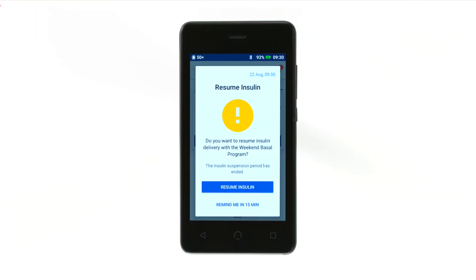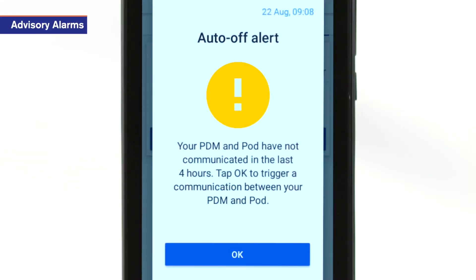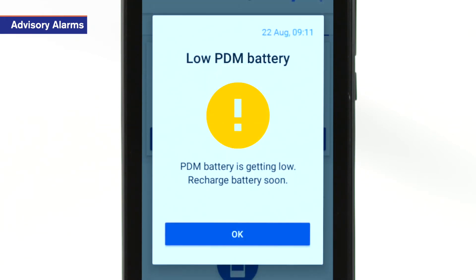Advisory alarms are lower priority alarms that inform you of a situation that needs your attention. Advisory alarms have intermittent beeps that may come from the pod and/or PDM.